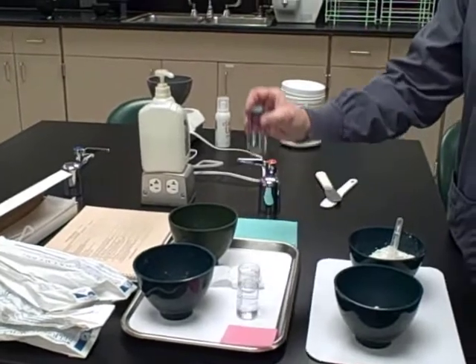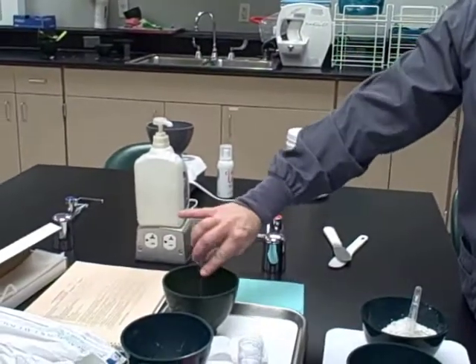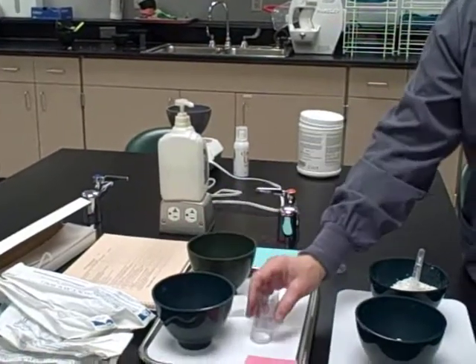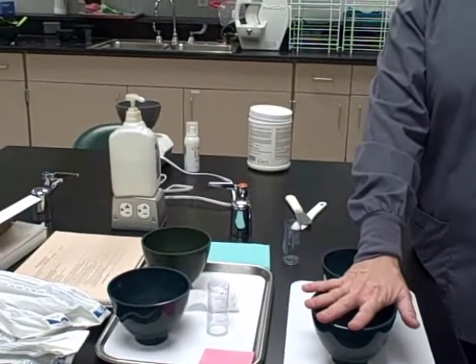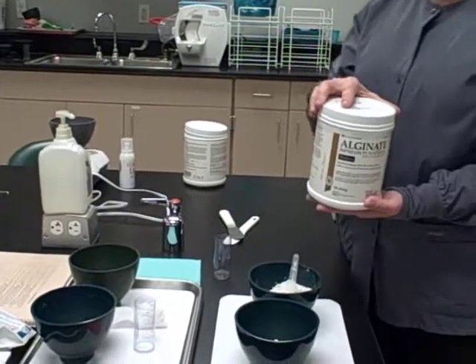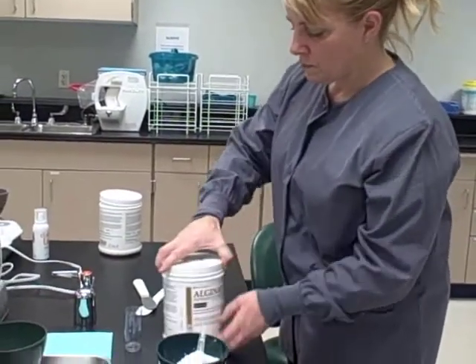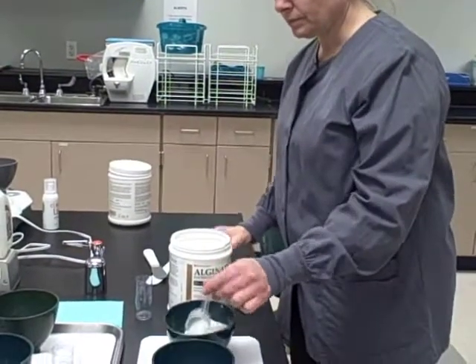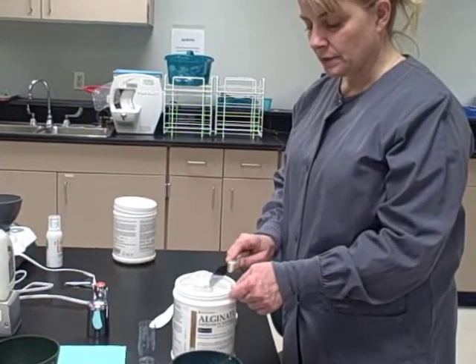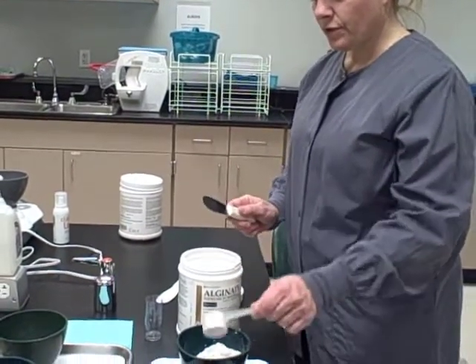We have three increments of water for the maxillary impression and two increments of water for the mandibular impression. That's going to go with two scoops in this bowl. In this bowl we have two scoops, and I'm going to show you how to put the third in there, because we need to fluff the powder. When we scoop the alginate, we're going to tap so that the powder goes evenly into the scooper. Then there's our third scoop.